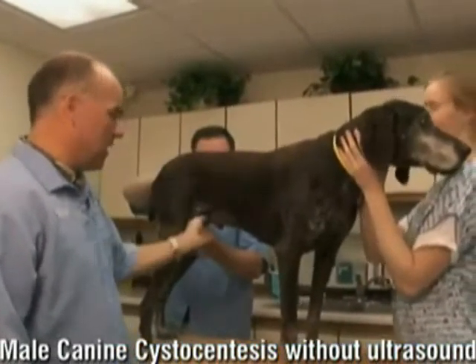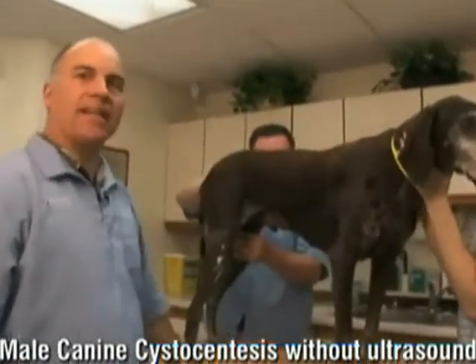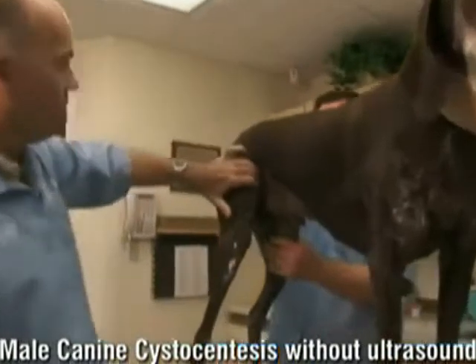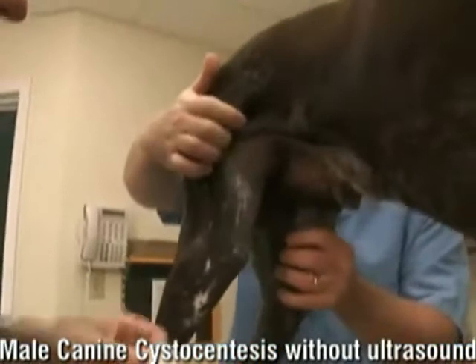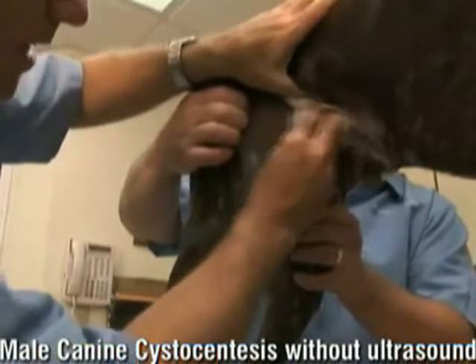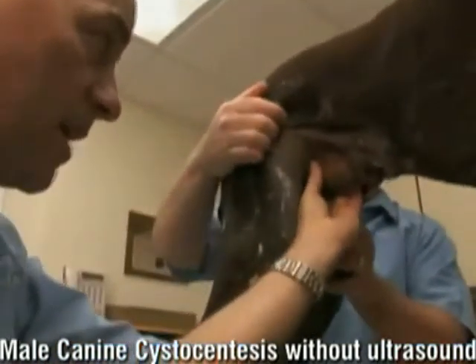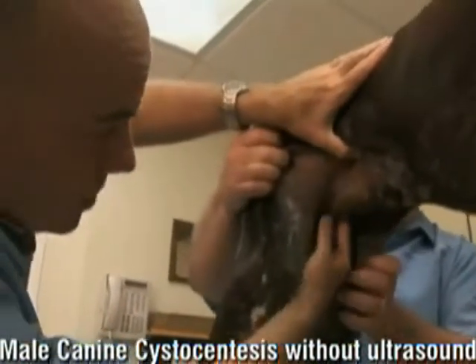This is Louie — he's an 11-year-old German shorthair hound mix, and he's a great example of a dog I would like to not lay down and stretch his legs behind him. You can see he's probably got some arthritis — he's got those skinny little old dog legs. We put him on the table here; normally I would just leave him on the floor like we did with the big Malamute, but we put him on the table so you can see better what we're doing. He's a male, so we thought we'd show a little technique on the male. I would just let him stand instead of trying to stretch him and pin his back legs down.